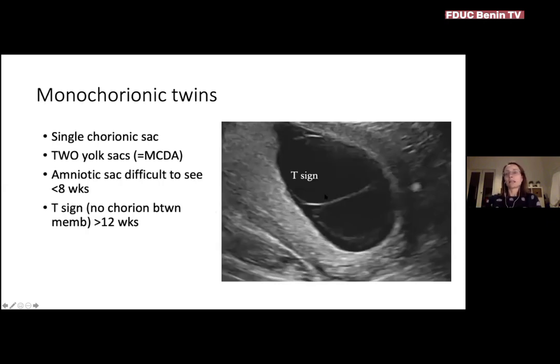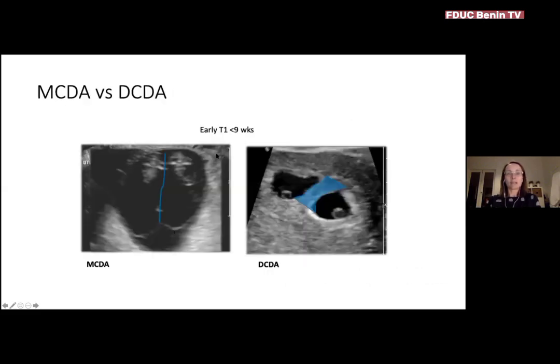As the amniotic sacs get bigger, they are obviously closer together and are compressing this empty area around the amniotic sac, and that forms after 12 weeks a sign that we call the T sign, and we'll have a look at how that develops now.